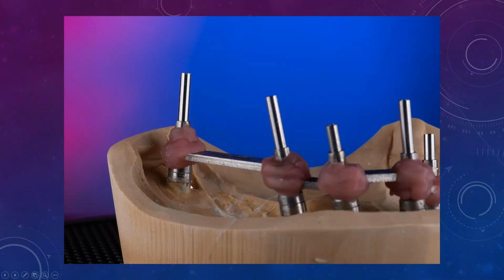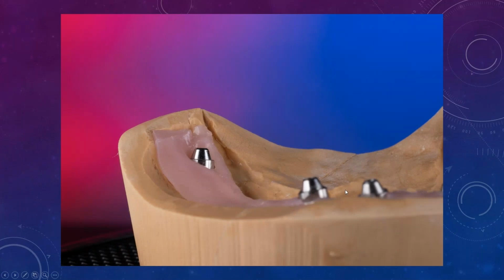And I will lute that new component in there, making sure it aligns with the verification jig to everything else on that model. And from here, I'll just replace the gingiva going back, and now we have our passive model back. Okay, so fairly easy to do.